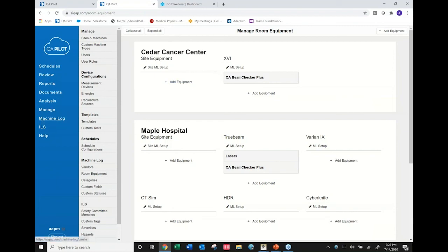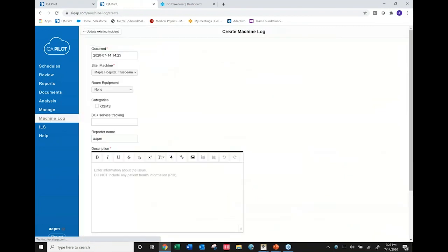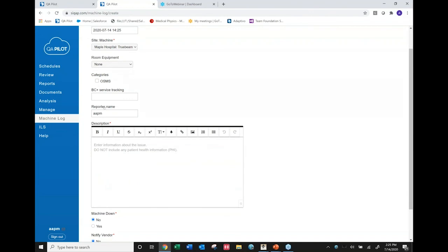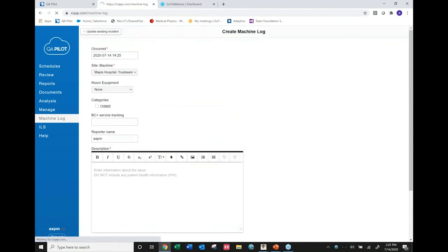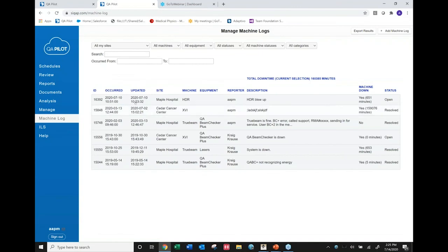So what does that mean when you're actually going in? Because from this blue menu is where you're going to be doing all of your actions. My mouse is not cooperating today. When did it occur? Where did it happen? I added a custom field. You can do that in the management section. Doesn't apply in this case. An opportunity to write as much information as you need to about what's going on. You can attach a document, and down here you note whether the machine is down and whether you want to notify the vendor. If you click yes and there's an email associated with that vendor, it will shoot off that email.